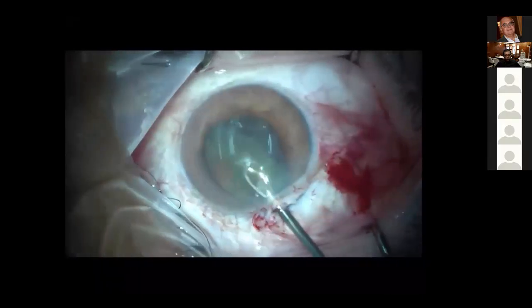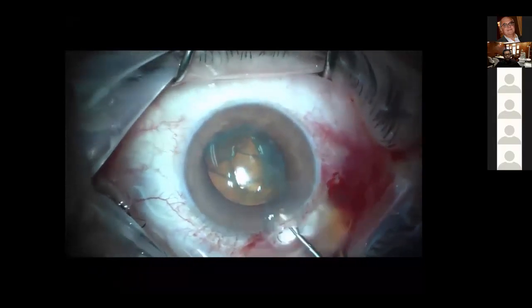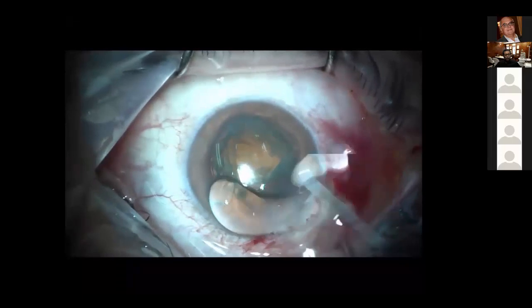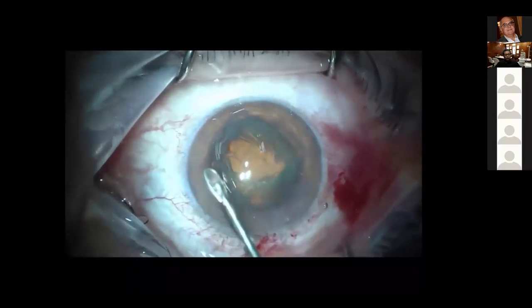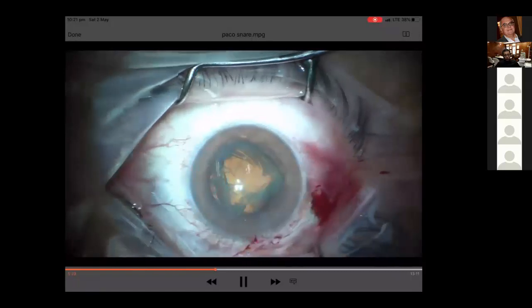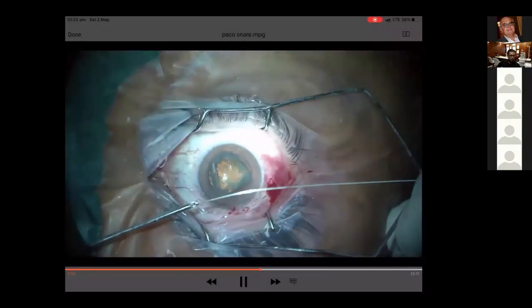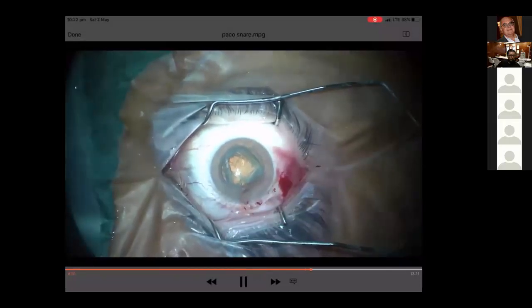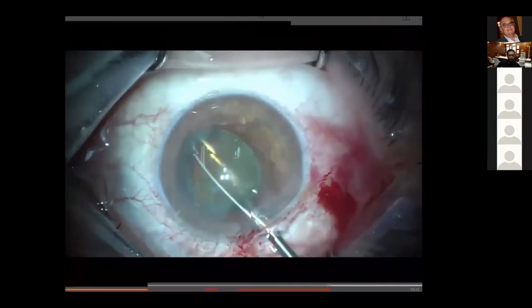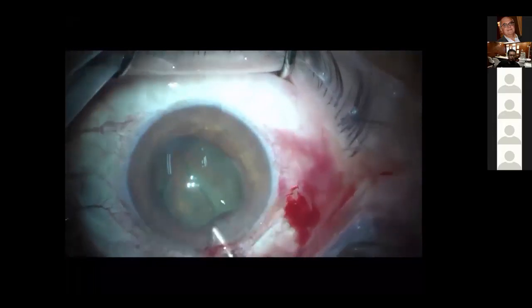And then you pull the snare and it will cut through the nucleus. And this is by simple pressure on the posterior lip of the wound, the portion that you have cut will come out quite smoothly. And then you rotate the nucleus in order to again introduce your snare and perform another cut. Again, I introduce my phaco snare once again in order to cut the remaining nucleus into two portions, which again I'm going to pull out through the posterior lip of the wound.